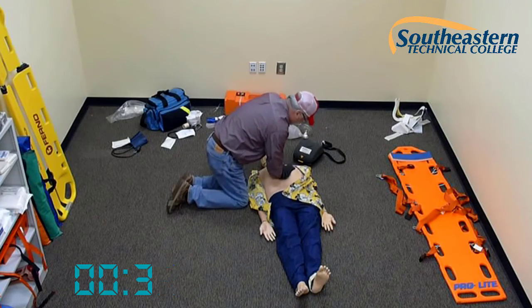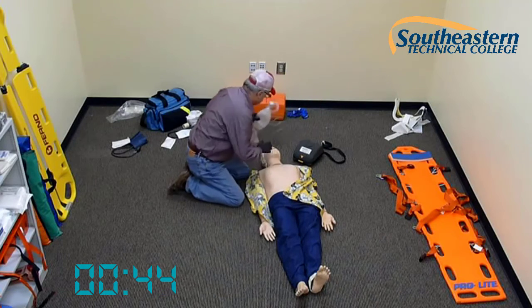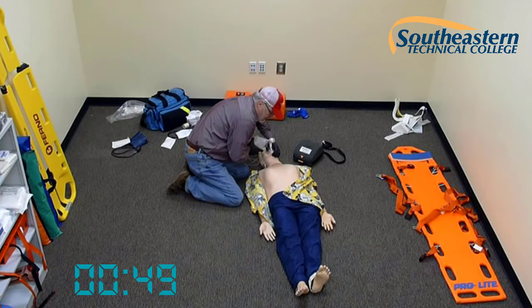14, 15, 16, 17, 18, 19, 20, 21, 22, 23, 24, 25, 26, 27, 28, 29, 30. Give 2 breaths. Do not stay off the chest any more than 10 seconds.